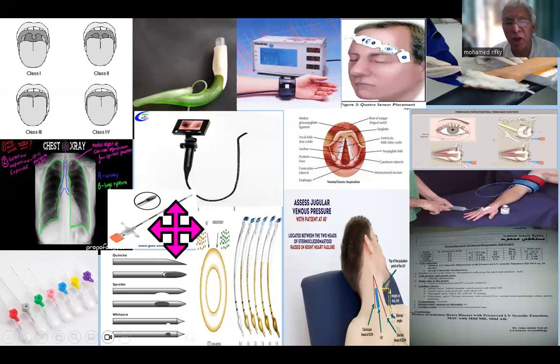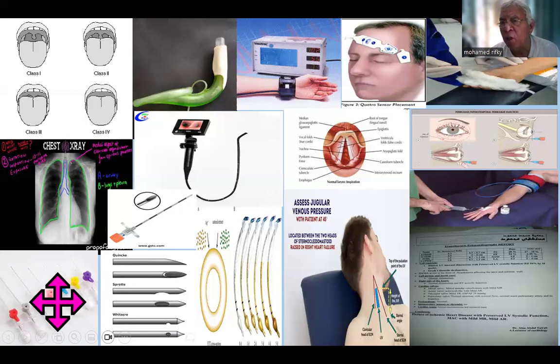And this is the epidural needle, like the spinal needles, but thicker. We will tell you later on what the duties of this needle are. And then these are different types of spinal needles. A recent one is what we call pencil-like. It looks like the end of a pencil, so it does not cut the fibers of the dura, so it lessens the incidence of headache. And then these are the sizes of the cannula from a bigger to a smaller one. In the middle one, which is the pink one, the gauge is 20, and the internal diameter is around 1 millimeter.